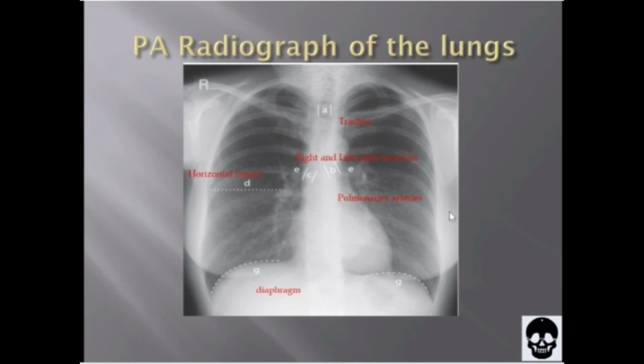With inspiration and expiration chest images, the diaphragm is demonstrated on expiration at a higher level, so that at least one fewer rib is seen within the lung field. Note: inferior lobes of both lungs should be carefully checked for adequate penetration on women with large pendulous breasts.